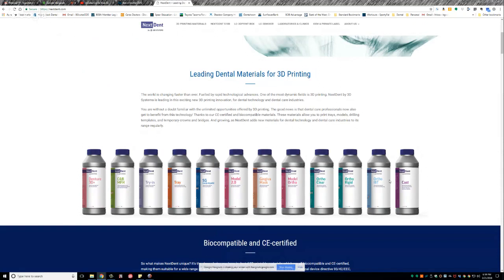Okay, I think that I'm hearing Sprint Ray is back ordered on most of the resins. Is there any other place to order from? Well, yes, you can actually buy your resin through Blue Sky Bio as well. As far as I know, they still have stock, but I know that they sold a ton, and that's why they ran out.